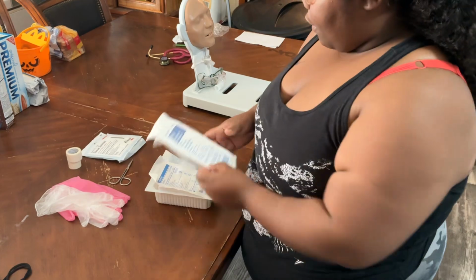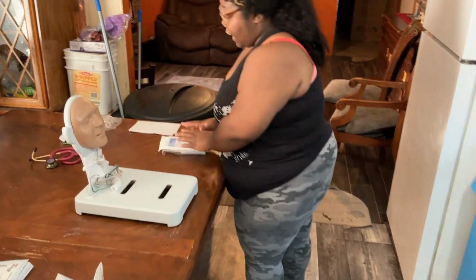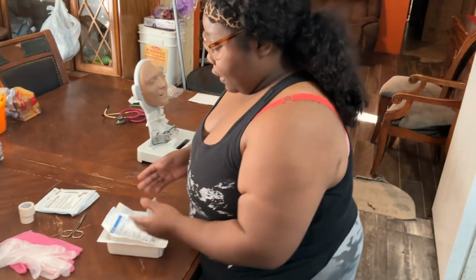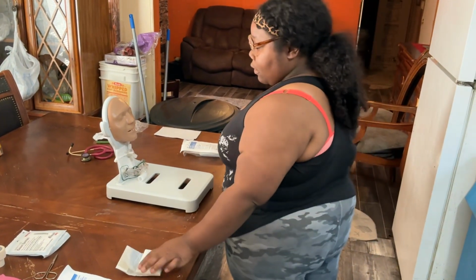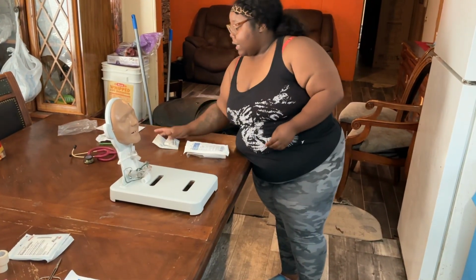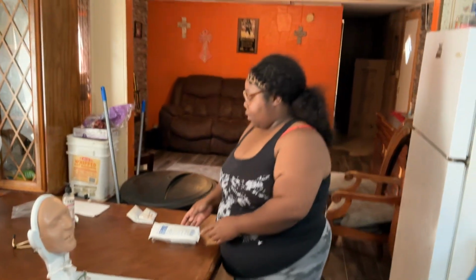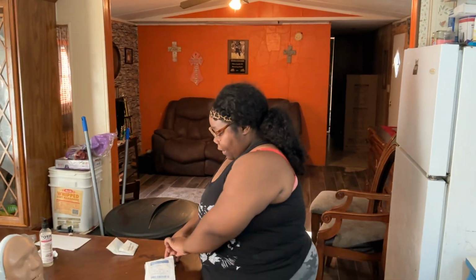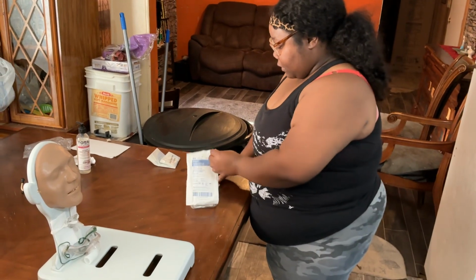Alright. So I'm going to go ahead and get my suction catheter kit. And I will say that I did use this catheter kit to practice with a little bit. So that's why it has been open. But in the real world, it will not have been open. So let's go ahead and get that together. Once again, I've already performed hand hygiene. So that's out of the way. Alright. So I want to open up my suction catheter kit. I have checked the expiration. It is within date.